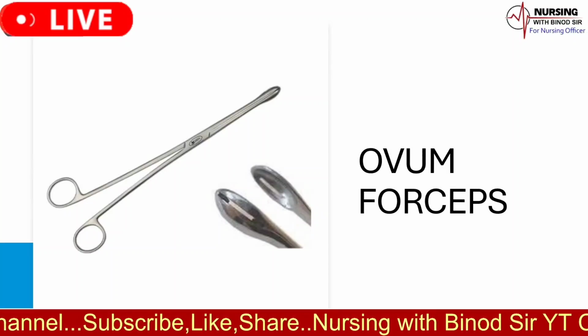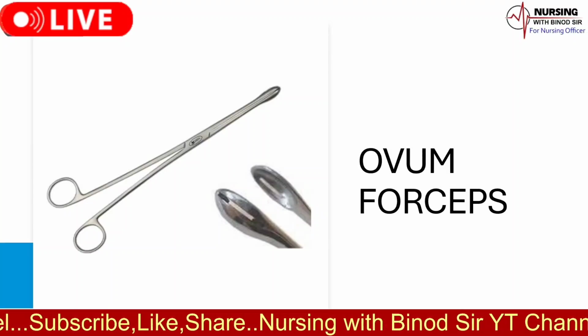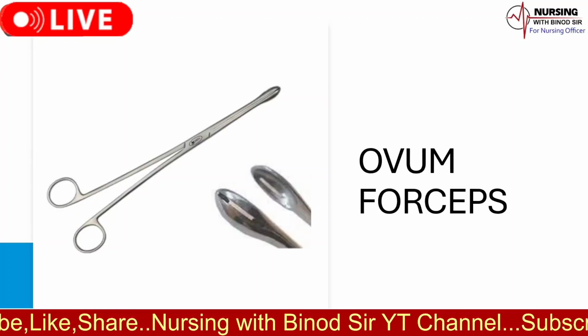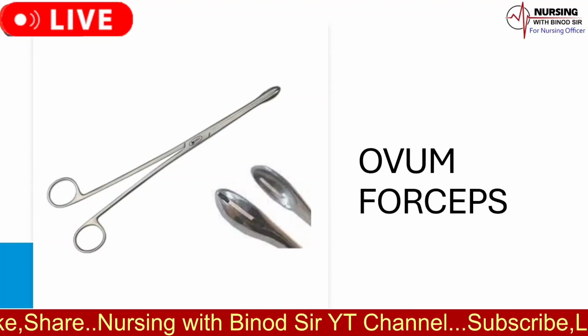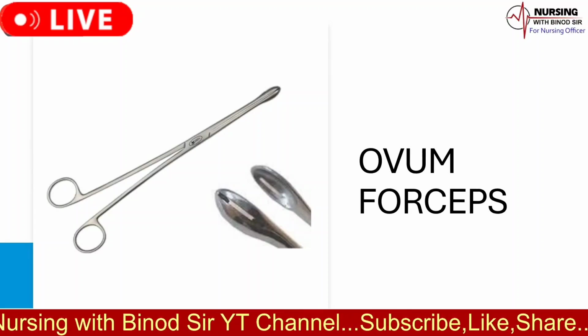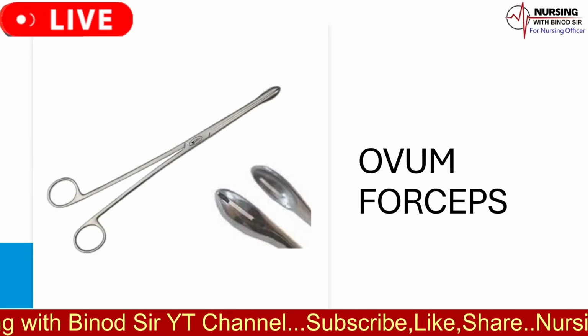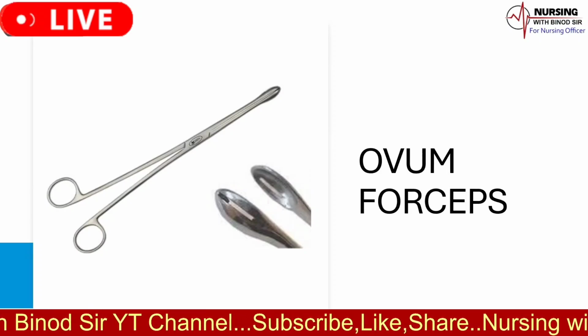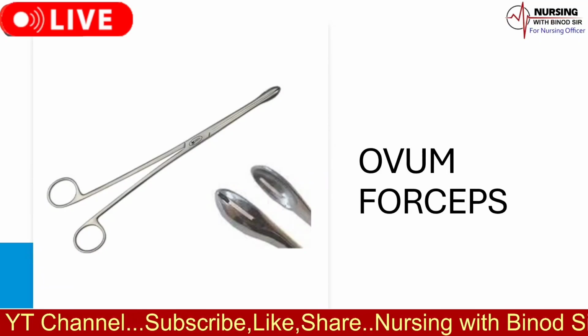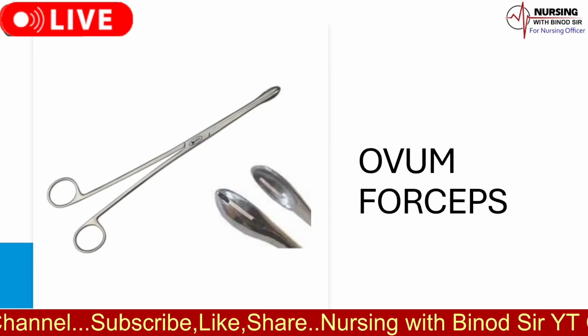2. Caesarean sections. During C-sections, they assist in handling the uterine tissues and placenta safely. 3. Uterine repairs and hysterectomies. Ovum forceps help in grasping and manipulating tissues during these surgeries. 4. Tubal ligations. They are used for blocking the fallopian tubes in sterilization procedures.